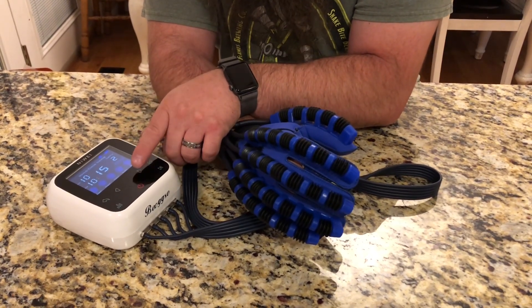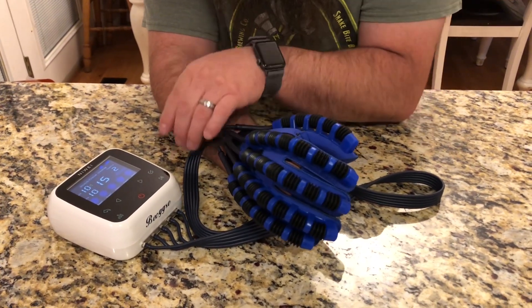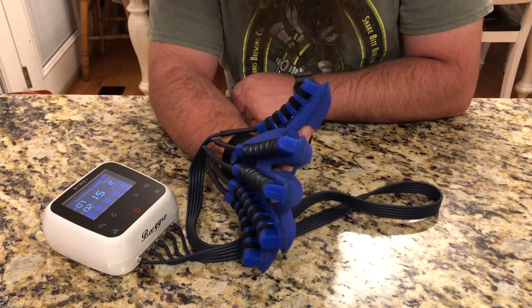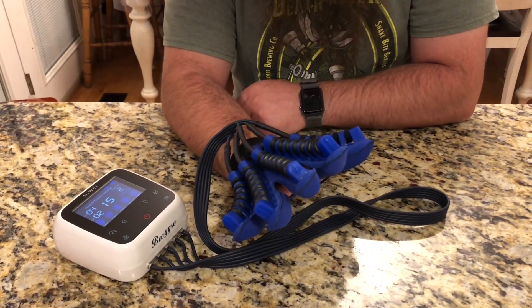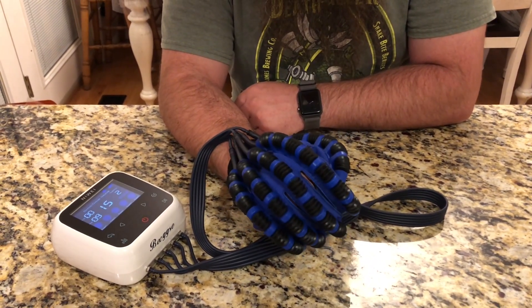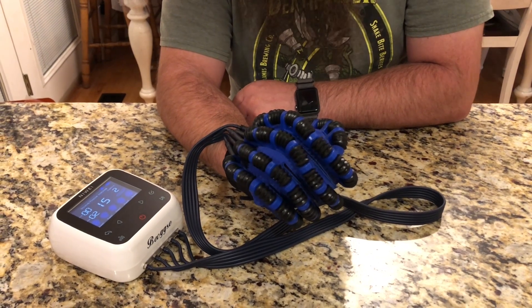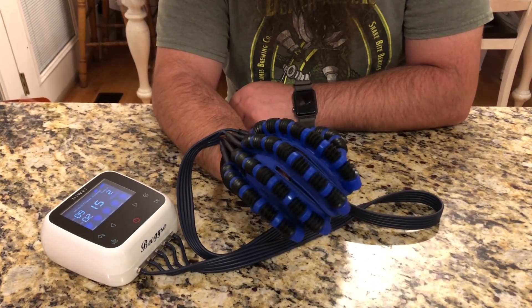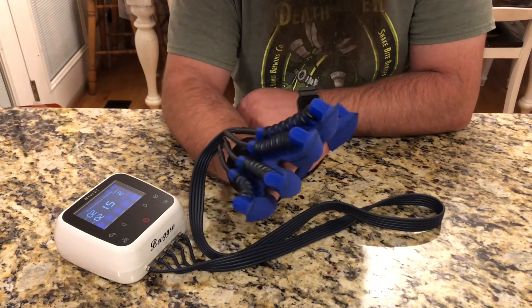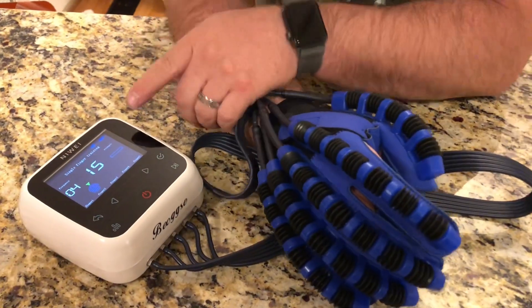I'm gonna do the stretch and flex mode first. I'll hit okay to go into it — it's got some settings I can adjust, but I'll just leave everything default. I push start and it immediately starts pulling my hand back. My hand is relaxed and it is doing everything for me, alternating between stretching and squeezing my hand into a fist. It does about 10 seconds for each one, switching back and forth to help stretch and flex my hand if I had suffered some kind of injury.